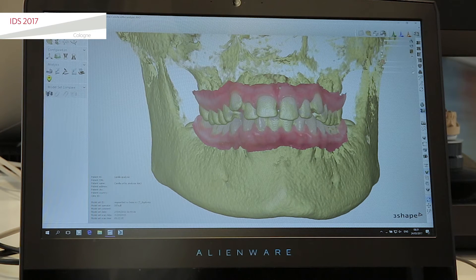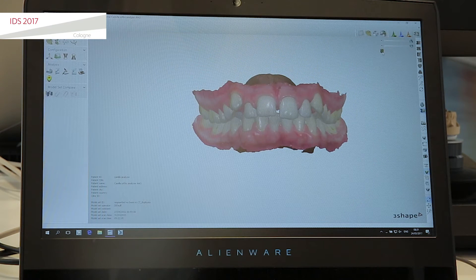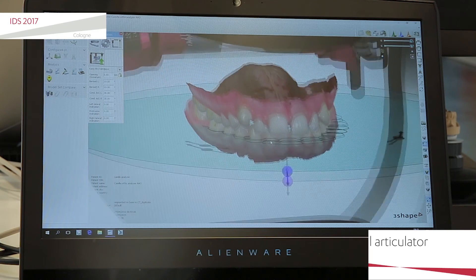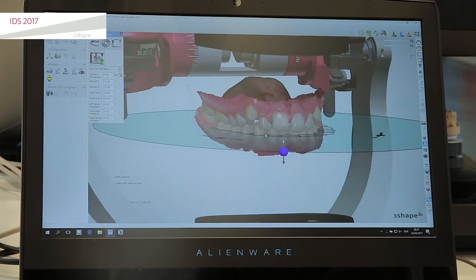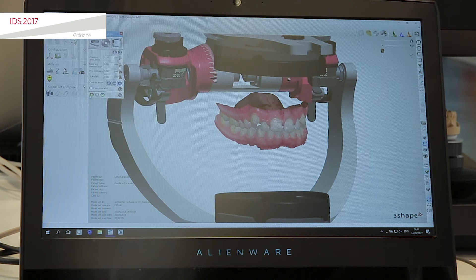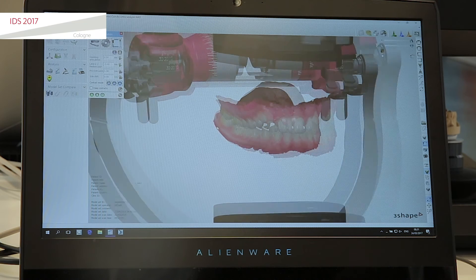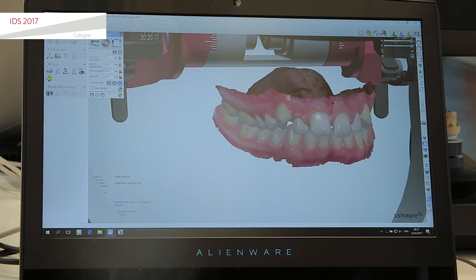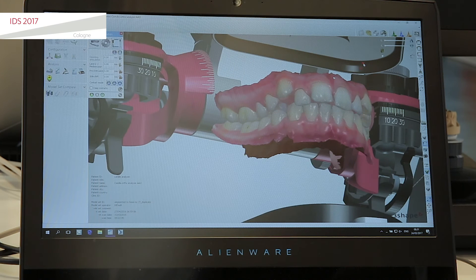One more thing I want to show you — you can also add what we call a virtual articulator. So not only can you look at these different types here, as you move the teeth around and start to do your treatment planning, you can actually have a look. Not only is it a beautiful bite, but you can check here if it's a functional bite.